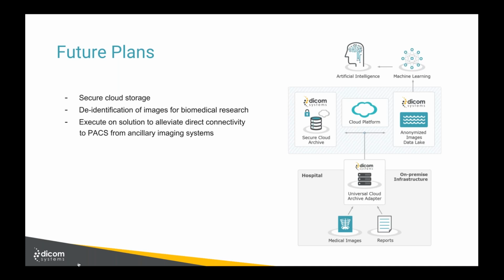So right now, again, with a monolithic PACS storing about a petabyte of data, compressed down to maybe 600 terabytes of data. Those are not numbers I should be quoted on, but that's a general estimate. We have a migration effort that pulls those studies out and pushes them to the cloud, but the rate of that migration is simply not fast enough for the clinical or the research purpose. They would like to investigate getting the data there faster.